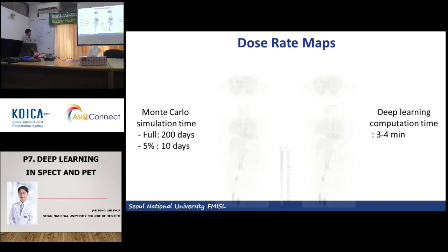And now with that image, the emitted radioactivity is going to be absorbed by some voxel of interest. So the entire body is a voxel of source, and the entire body is a voxel of interest to receive. We need to estimate how many grays or sieverts of absorbed dose are going to be received.